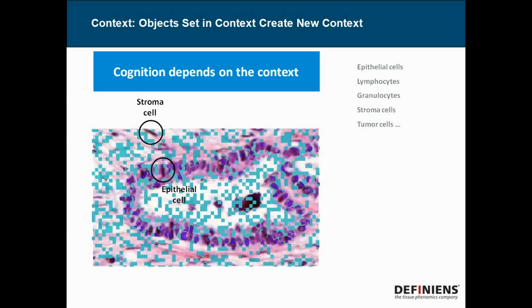So it starts down at the pixel level, where the technology looks at pixels and similarities between them in order to group these like pixels into larger superpixels, or what we refer to as objects. In this case, the pixels encompassing the nuclei have similar characteristics, and so they get segmented. The second step is to classify these. The classification can either be based on a completely unsupervised machine learning, or it can be based on some known characteristics, for example, the color, the shape, or the density. And so using those 2 basic technologies, we can segment and classify all of these objects into nuclei.